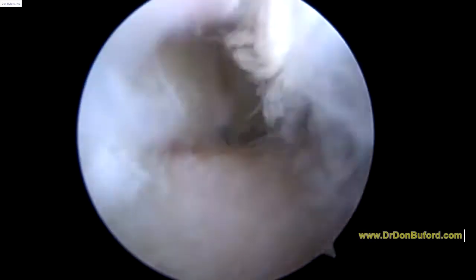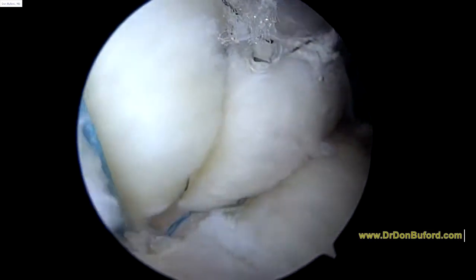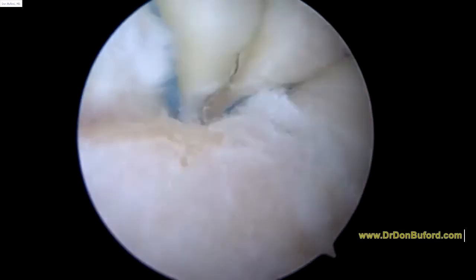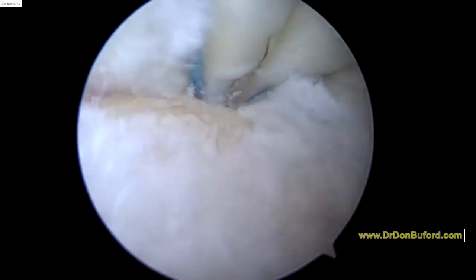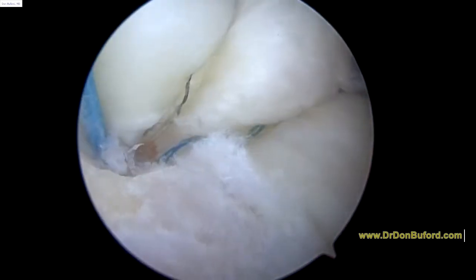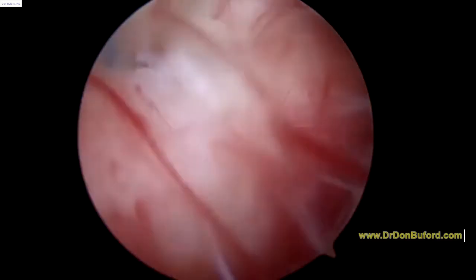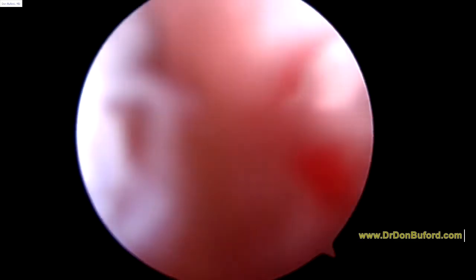Okay, so those are our little orthobiologic bone marrow vents. We're going to turn down the pressure on the pump. So the picture's going to start to get a little cloudy because the pressure's coming down. So you just want to look at our little vents in the bone and just kind of show you how the marrow starts to come out. See the yellow marrow starting to come out there, so that's good. That's where some of the bone-derived stem cells live. So we're going to finish up here and get you back to the recovery room shortly.